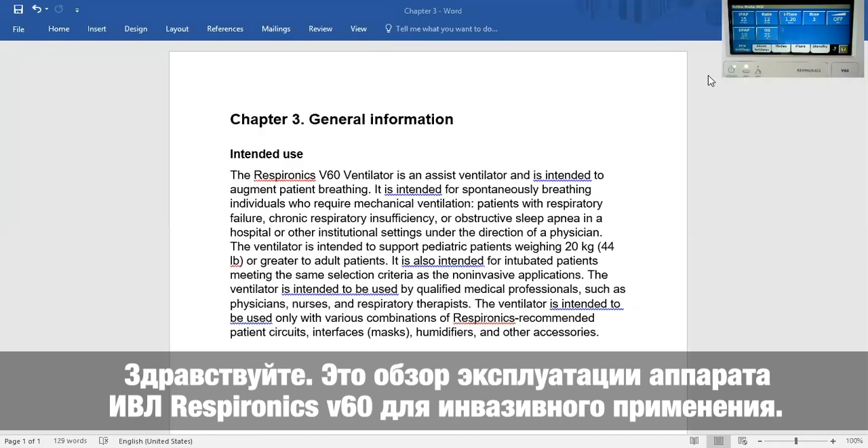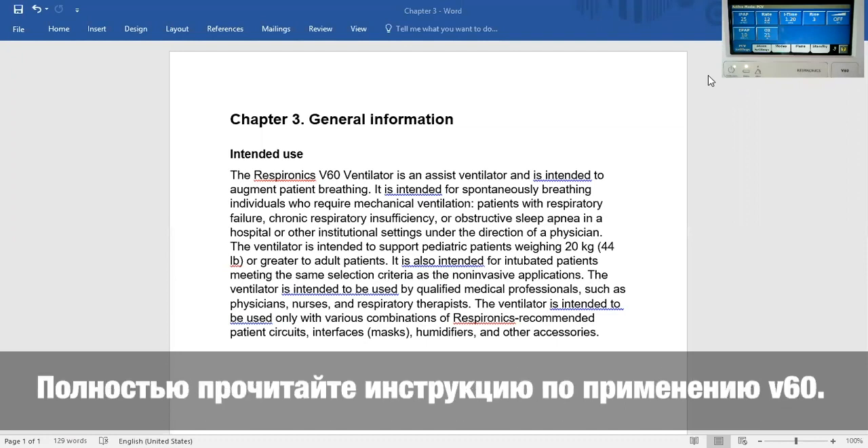Hello, this is an overview of using the Respironics V60 Ventilator for invasive purposes. Read the entire V60 user manual.